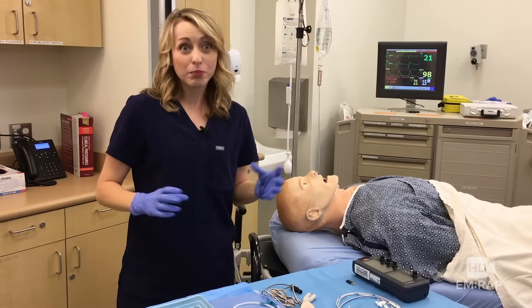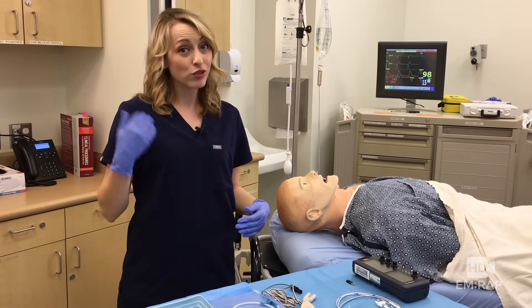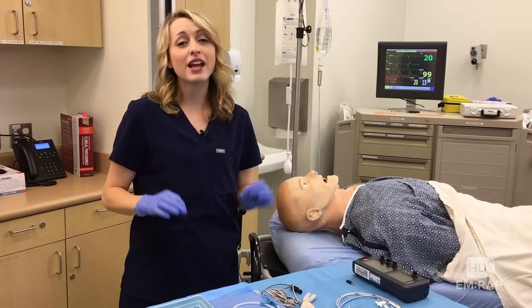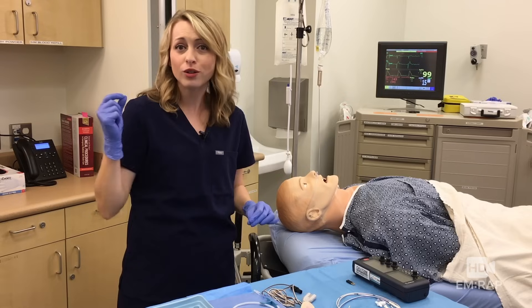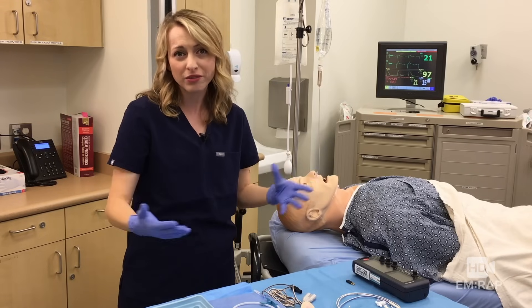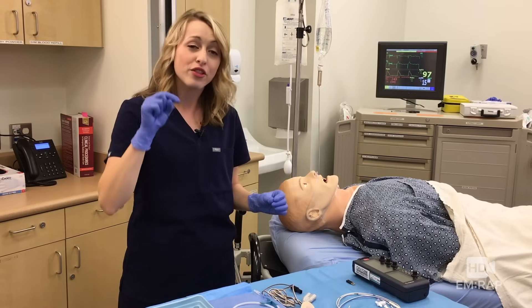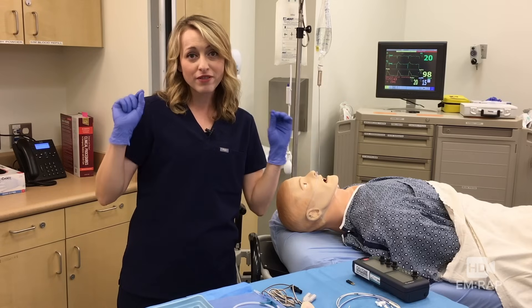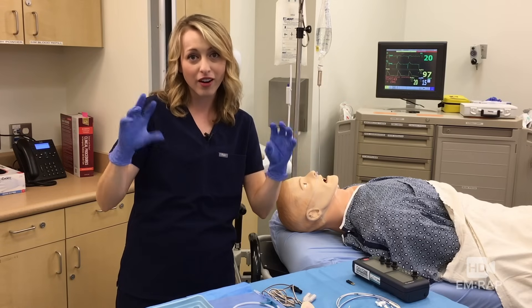Placing a transvenous pacer is pretty much exactly like putting in a big central line in the right IJ, with the only difference being that we're putting in a single lumen cordis line in the right IJ instead of a triple lumen that you may more typically use. Then through that single lumen, we're going to put in a pacing wire that's going to go all the way down to the right ventricle where it's going to pace the heart.